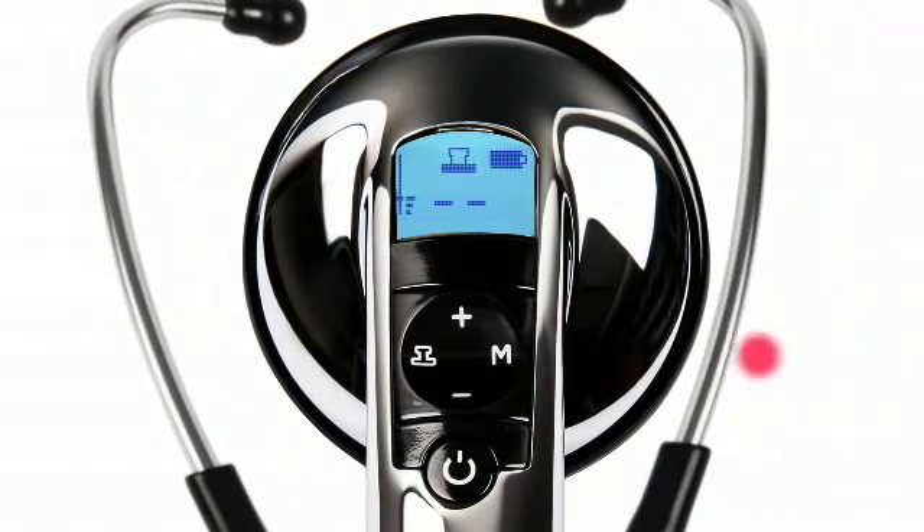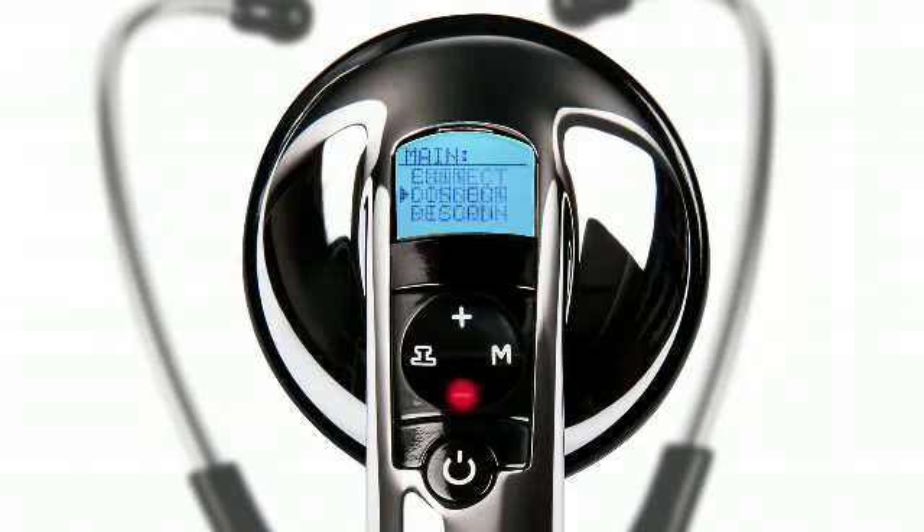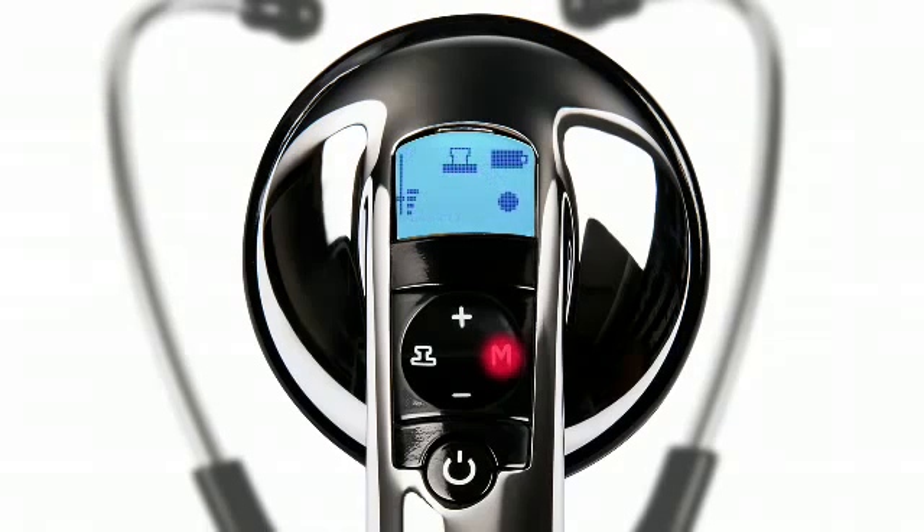To record a patient soundtrack, press and release the M button. Press the minus button to scroll until record is highlighted, then press and release the M button.